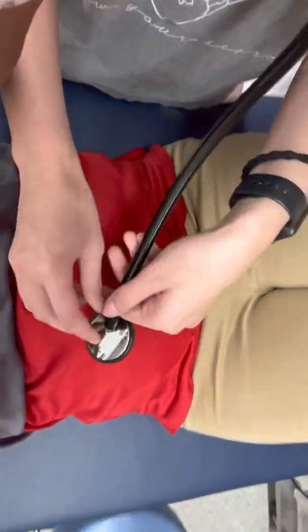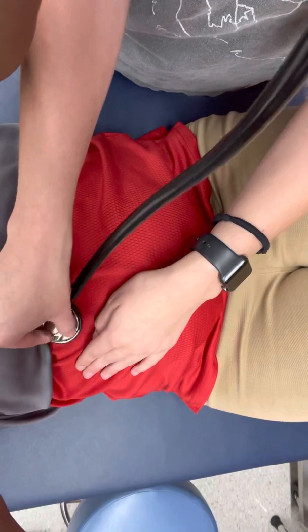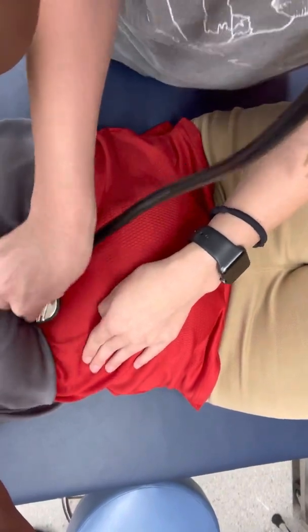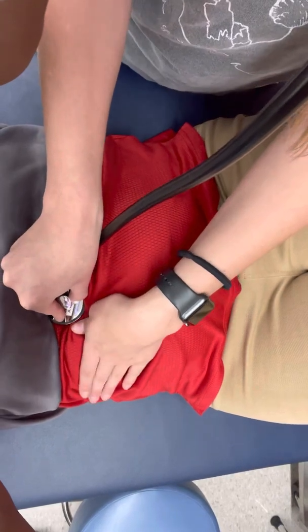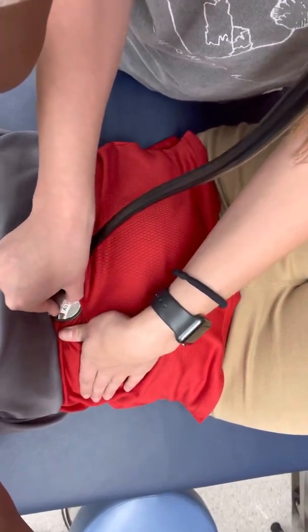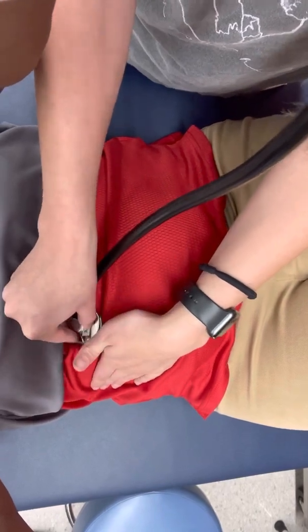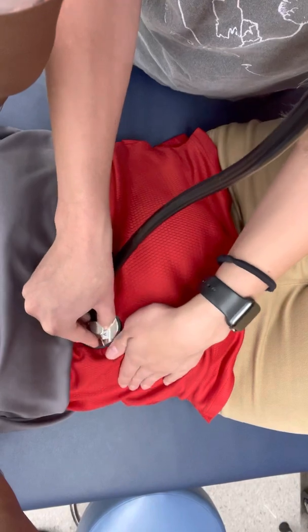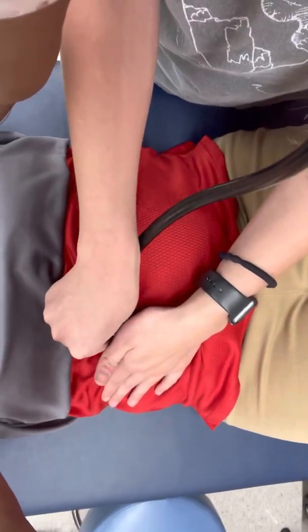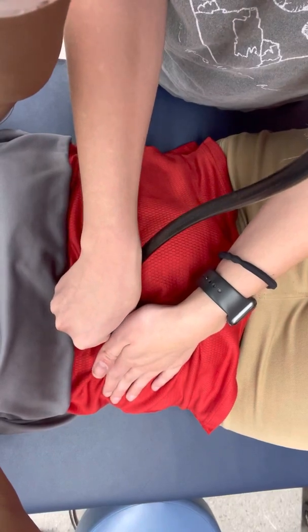Here we have number 1 patient Quageline, and we're starting with auscultation in the upper right quadrant. I can hear her lung, her right lung, portions of her small and large intestine. I hear a little bit of her renal artery.